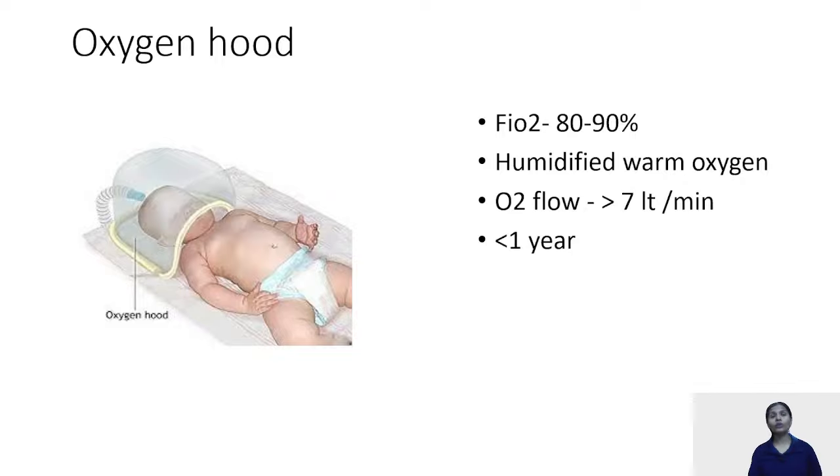When we talk about the oxygen hood, as you can clearly see from the diagram, it is meant for kids less than 1 year. Done. The FiO2 which is delivered is around 80 to 90%, and it is humidified. The best part is it is humidified.